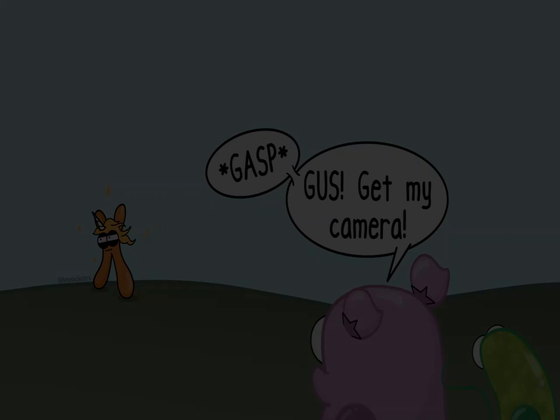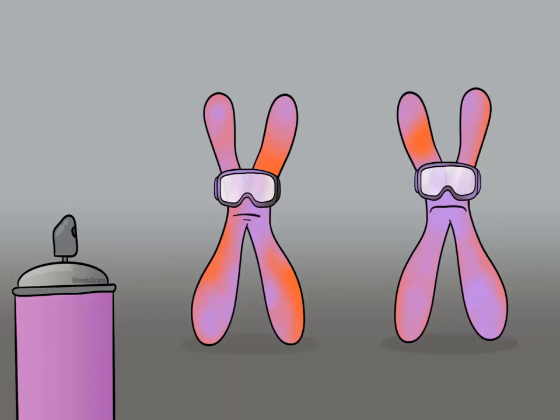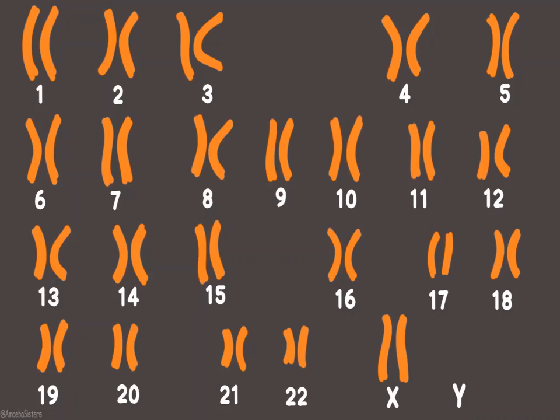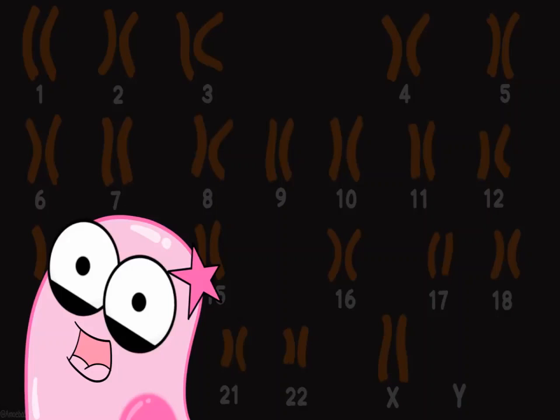Well, you could in something called a karyotype, an image of all your chromosomes. It's possible to have a karyotype made as part of some types of medical screenings. In a karyotype, the chromosomes are stained and visible. The chromosomes from a karyotype are typically from a cell that is in a mitosis stage, typically metaphase. As chromosomes are condensed and thick, a karyotype during interphase would be a challenge because you don't have that condensed DNA packing.